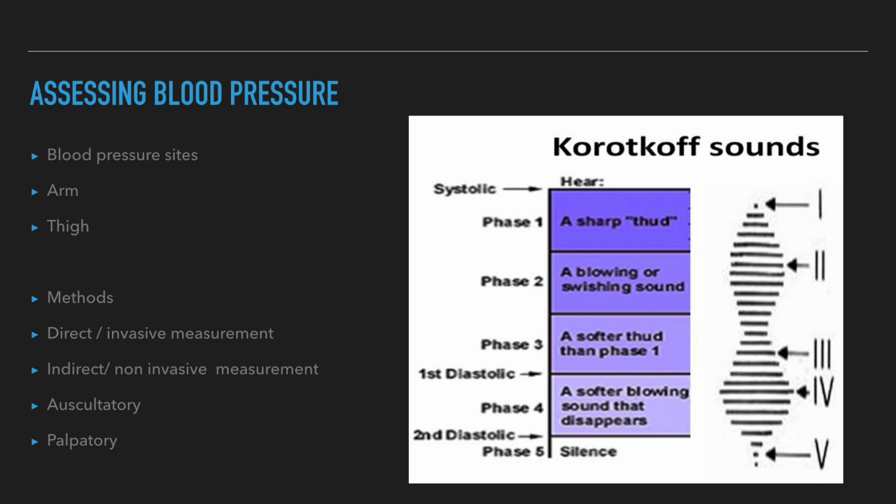Find the auscultatory gap by palpating the brachial or radial pulse while inflating the cuff. Inflate the cuff about 30 mm Hg above the number where palpable pulsation disappears. In addition to detecting an auscultatory gap, palpation gives an initial estimate of systolic blood pressure and eliminates the need to inflate the cuff to extremely high pressures in people with normal or low blood pressure.